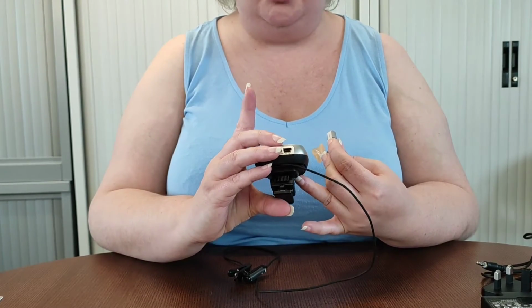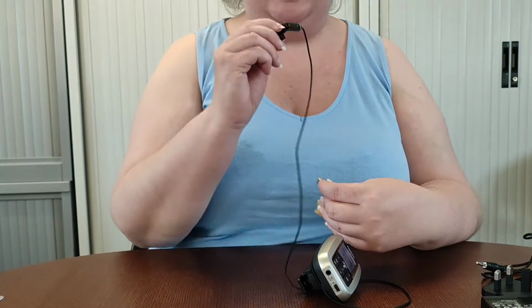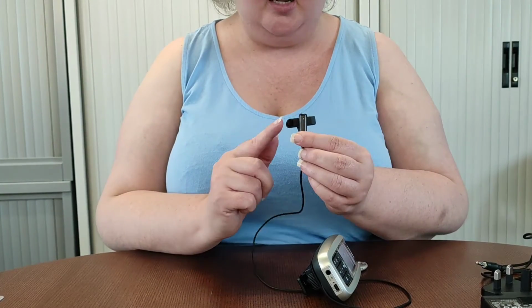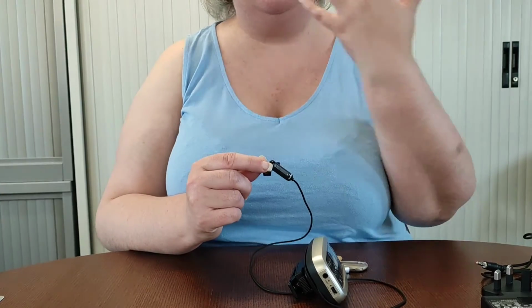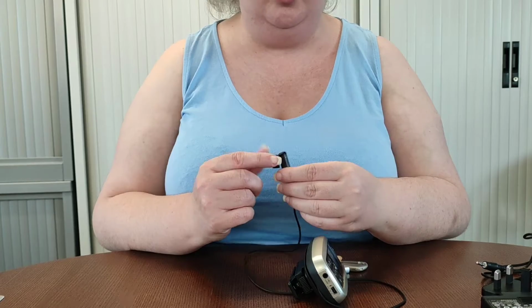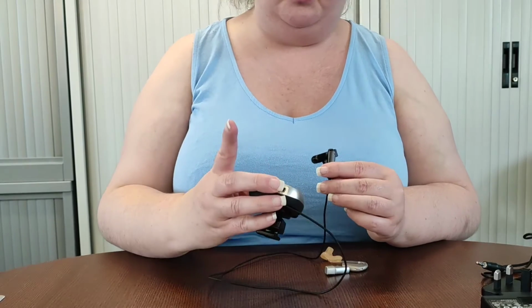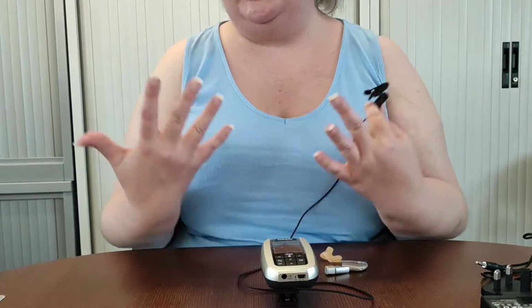And we need to make sure there's not anything rubbing on the microphone when we're wearing that, because that will be transmitted straight to the hearing aids and will be rather unpleasant for your learner. Once we have that connection, we might need to do that for both hearing aids if there are 2 devices, or other devices if there are 2. We need that same process of just pressing that button to connect really near the device. Now, in some circumstances, it might not connect, and what do we do then?